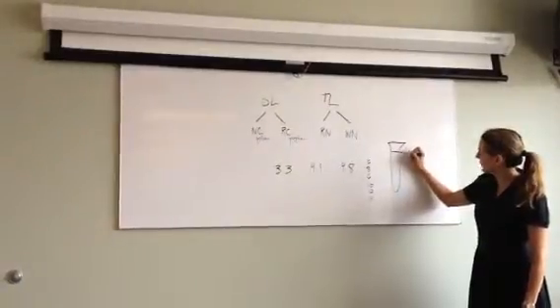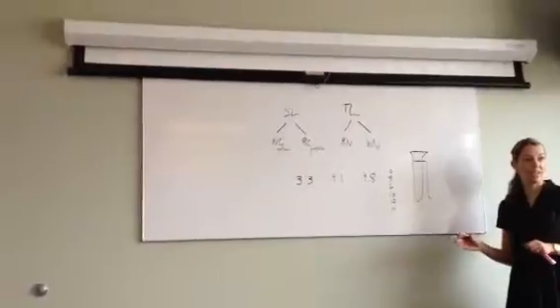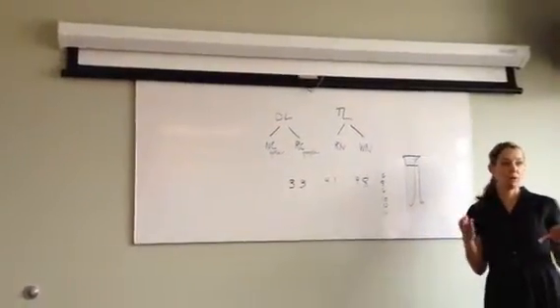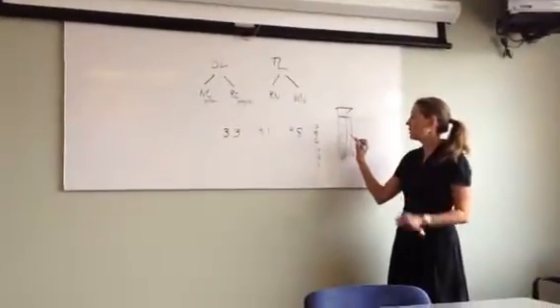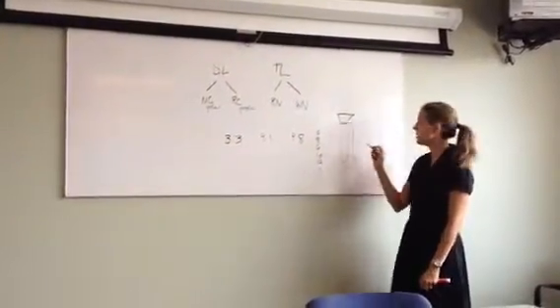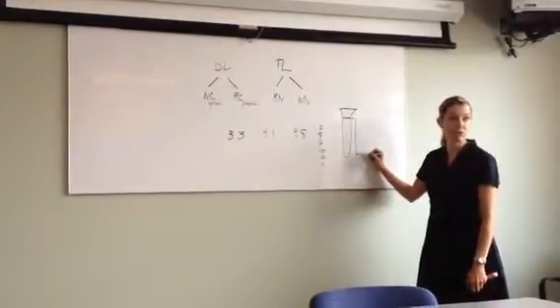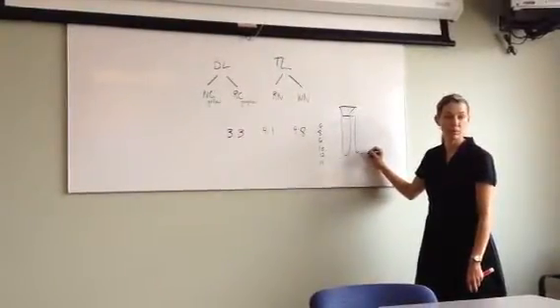So surgically, when you're looking at how much bone you have in a site, you're making a decision about diameter and length. And know with the tissue level, the length is from the bottom of the collar down, just the rough surface. Okay.